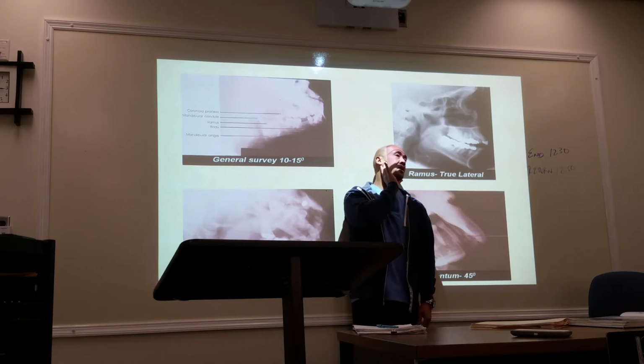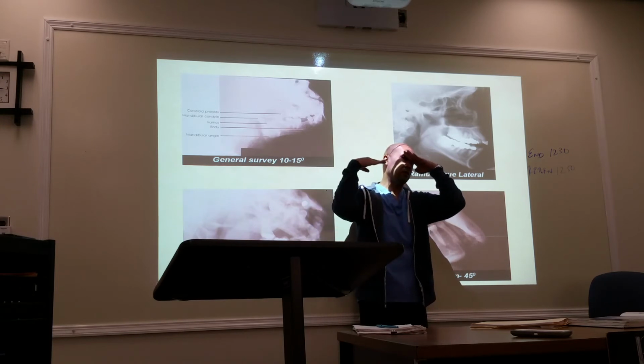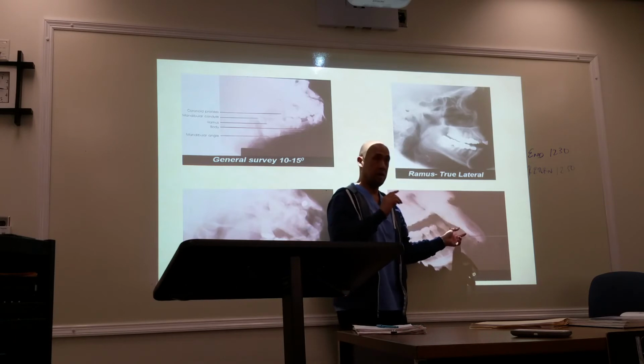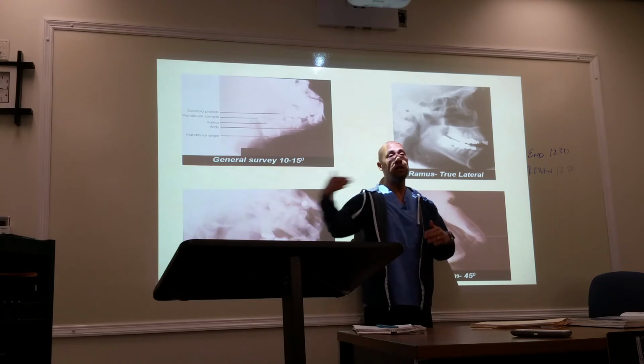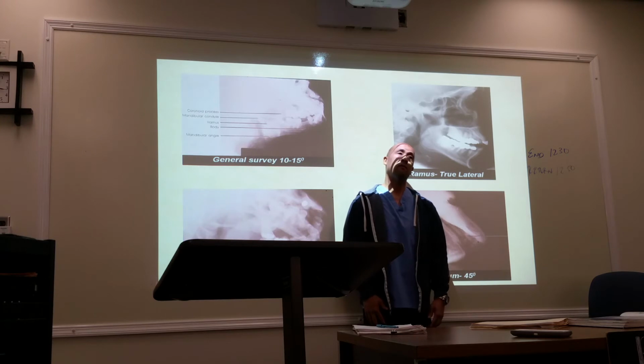You're still going to maintain the 25 combination of the head tilt and the tube angulation. Again, the 25 is going to be formed between your interpupillary line and your central ray. So this right here is, again, the combination of central ray and your interpupillary line forming 25.